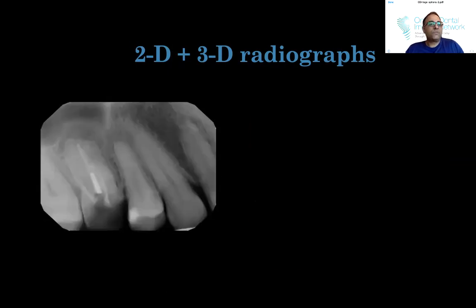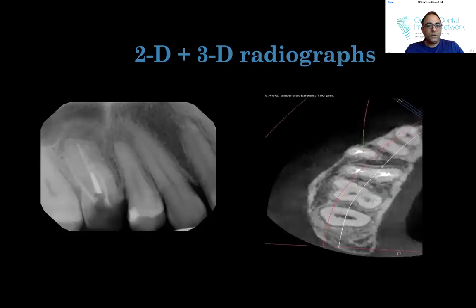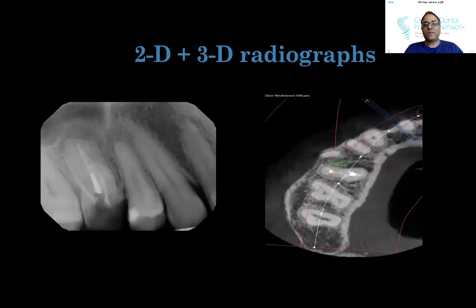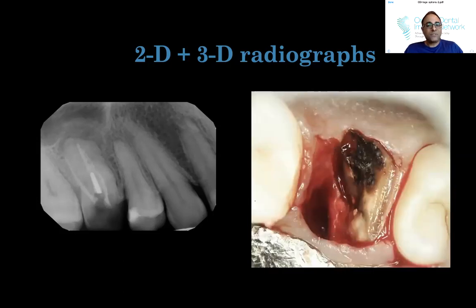Now, if I look at this case for an immediate molar, or just extraction of the tooth, for those of you who don't feel comfortable, when we go through the axial slicing, what do you notice here? You notice the distal buccal and palatal roots are joined. So if I tried to section this tooth, and again, welcome to my life, large apical lesions, we're doing immediates in all of these cases, I have to section this almost like an L. I remove the mesiobuccal root, and I keep the distal buccal and the palatal there.